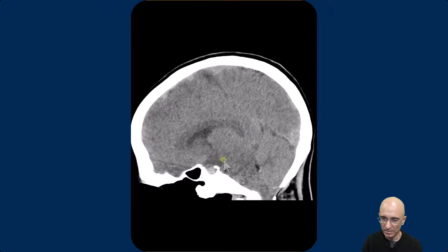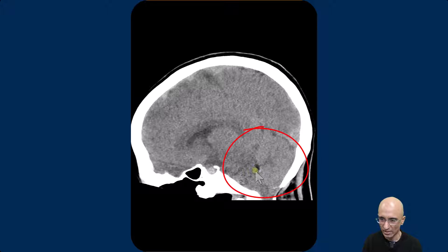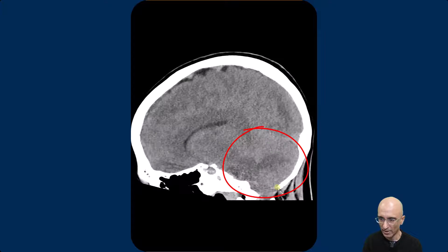On the sagittal images, you can see the pituitary gland appears prominent. There appears to be sagging of the entire posterior cranial fossa. There is mild tonsillar ectopia into the foramen magnum.